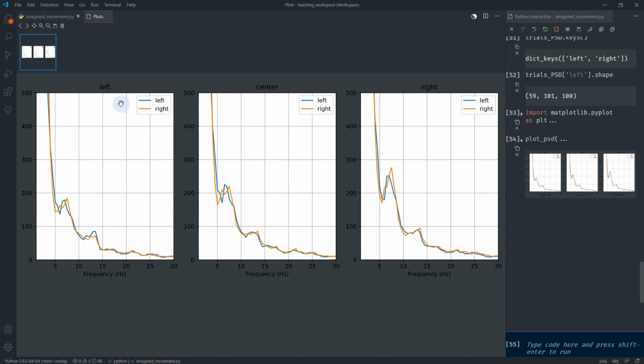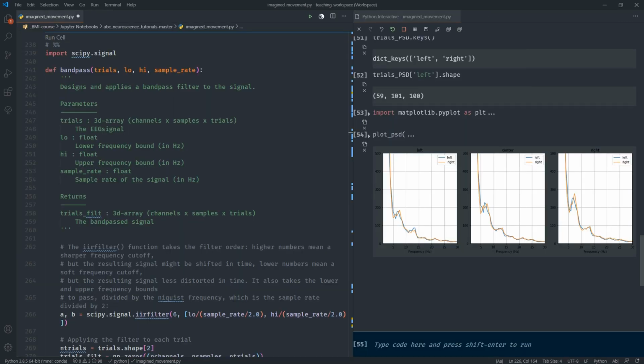At the left electrode, the mu for the right hand movement is reduced around 8 to 12 Hz. We are interested in this band. And at the central electrode, the mu band is about equal for both classes. This is in line with the theory that right hand movement is controlled by the left hemisphere, left hand movement is controlled by the right hemisphere, and leg or foot movement is controlled centrally. Our eventual goal is to classify these data for BCI control.